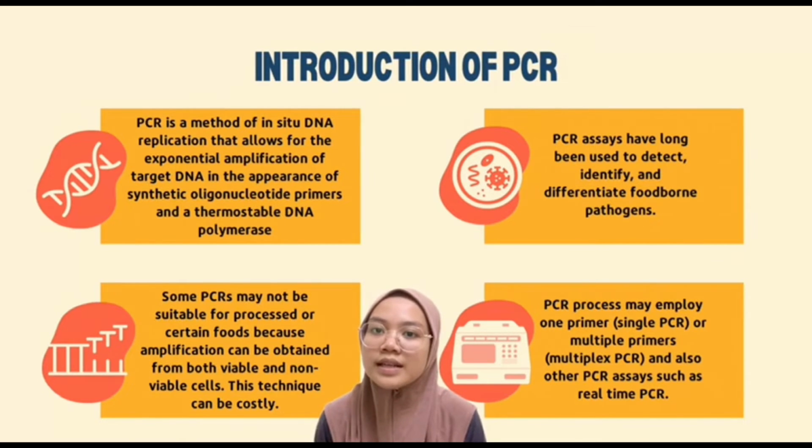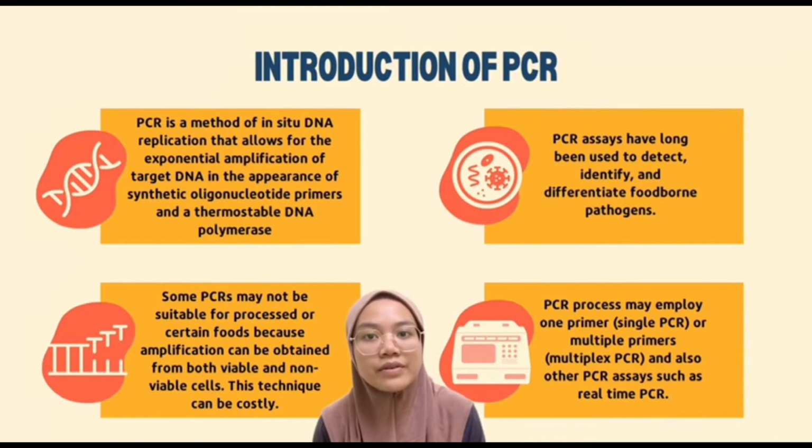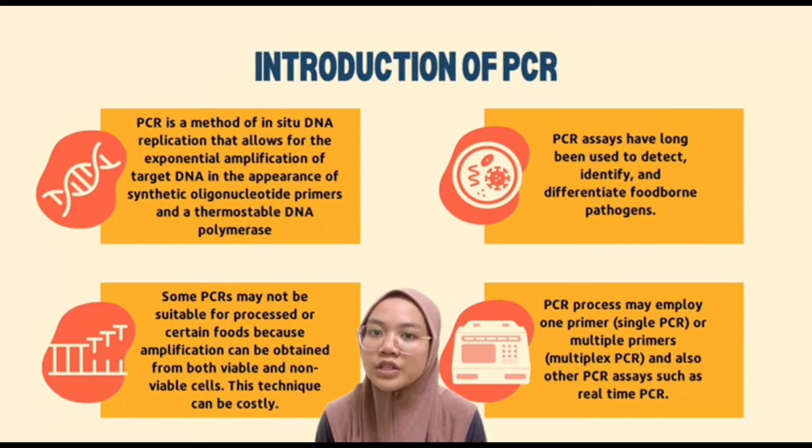Polymerase chain reaction assays have long been used to detect, identify, and differentiate foodborne pathogens. The polymerase chain reaction technique is useful for identifying typical bacterial strains that exist in a viable but non-culturable coccoid form and are frequently missed by the conventional method.